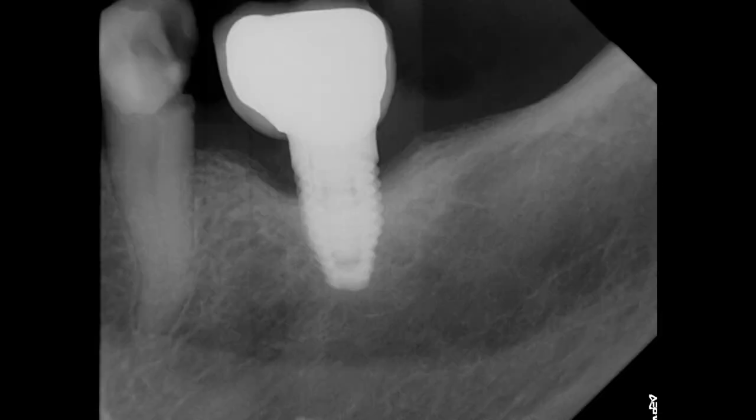Dr. Tanner Dobson here, and in this video we're going to be doing a root canal and a crown prep on a lower left second premolar that ended up with a big cavity into the nerve. Here's a PA showing that there's no lesion, but the tooth tested negative to EPT, and that's a failing implant that we're going to talk about later in the video.